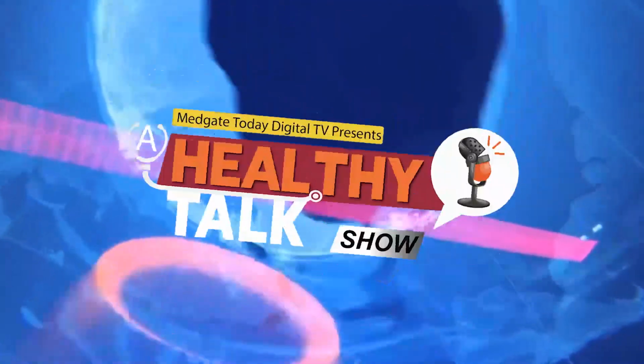This is very important, because the main role of diagnostic radiology is to try to find why the patient has pain. In some instances, performing the standard MRI, we don't see the reason for the pain. But when we perform this MRI in a standing upright position, we see changes and we see why the patient feels pain. This is the big power of weight bearing MRI.